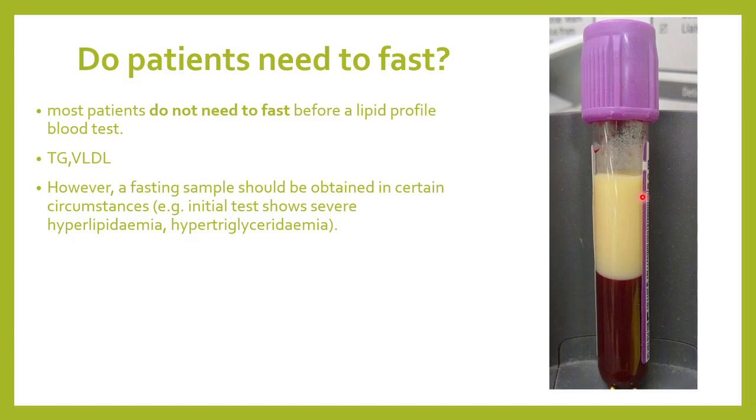And that is because nowadays studies have shown that even without fasting, if the patient is fed, still the lipid profile will be acceptable, and there is not much of a difference. Some parameters like TG, VLDL, etc. might be slightly increased, but otherwise there is not much of a difference. And nowadays we prefer post-fed samples for lipid profile also. So it depends on the laboratory. If possible, you can give a sample on fasting, around 8 to 10 hours of fasting.